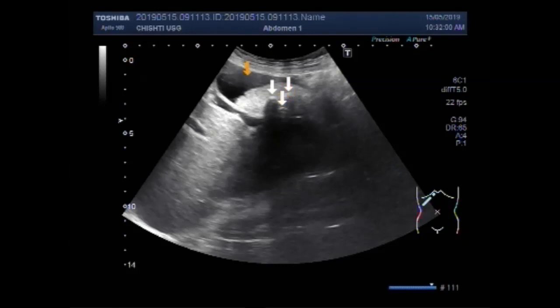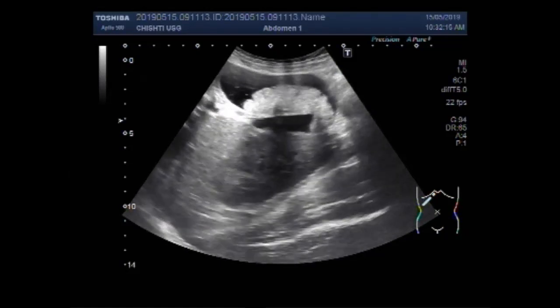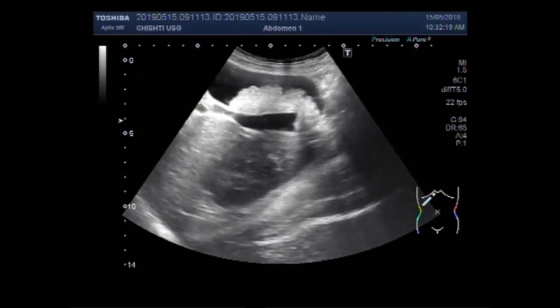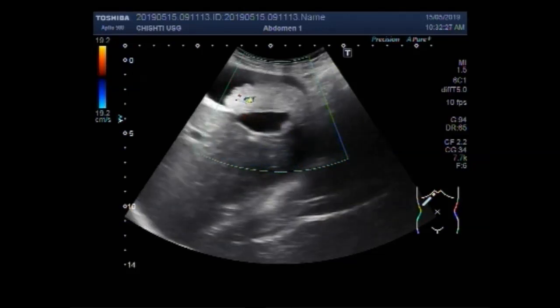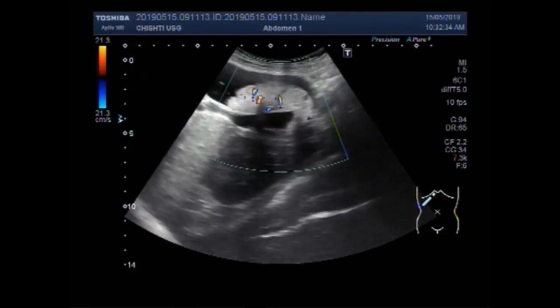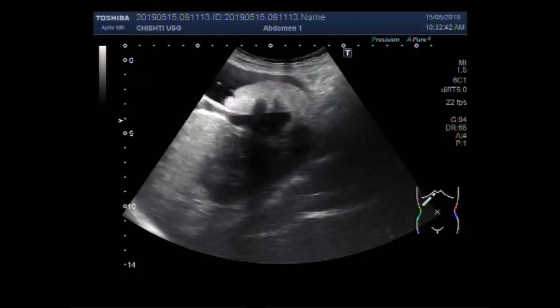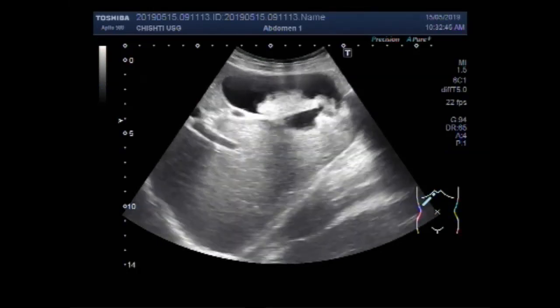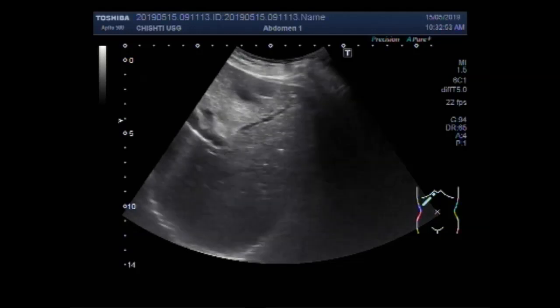These are the stones — the stones impacted in the sludge. You can clearly see the gallbladder stones involved in the thick sludge.